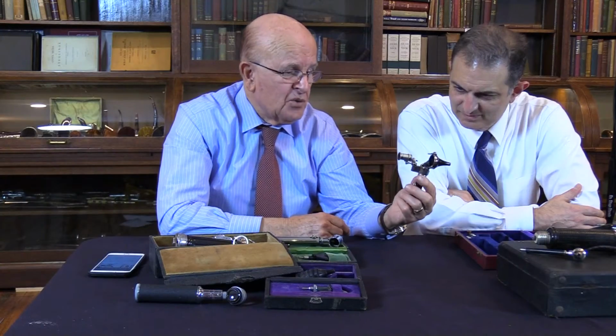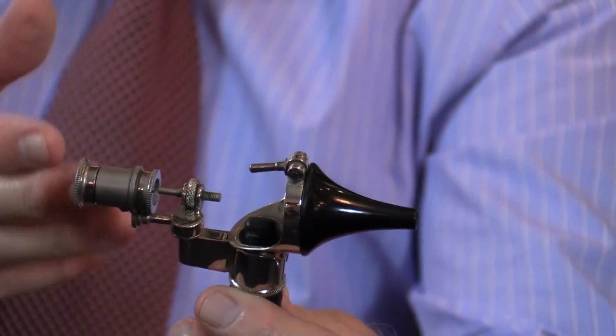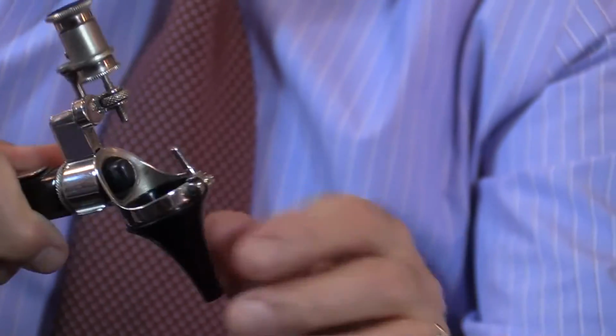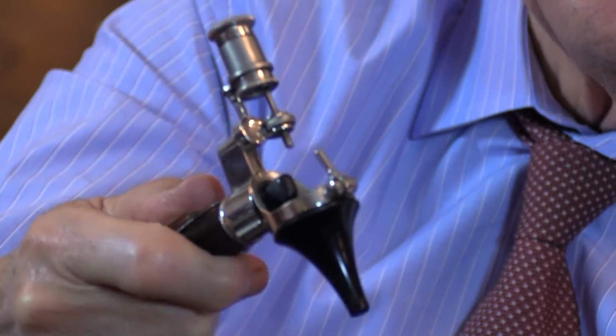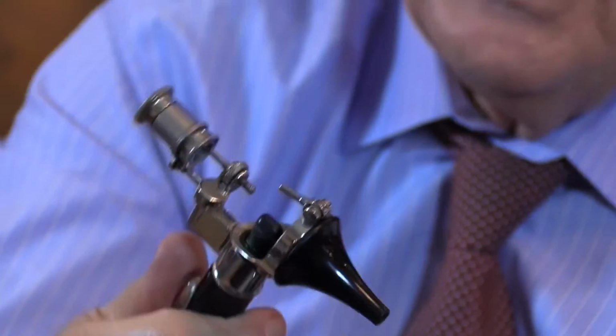I have the patent for this. It's about 1880. And with this here, you can release this to get the ear speculum out. And if you look at this here, you can move the light source up and down to center it towards the tip of the ear speculum.